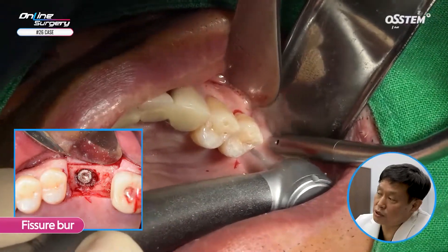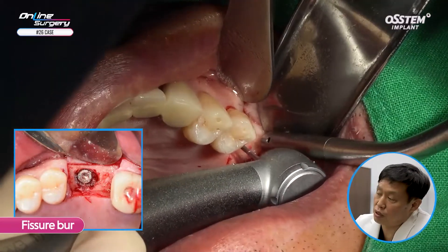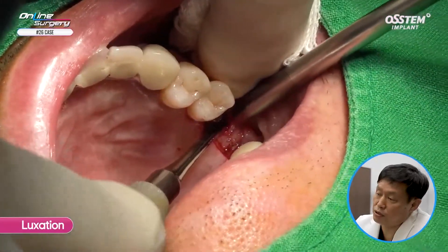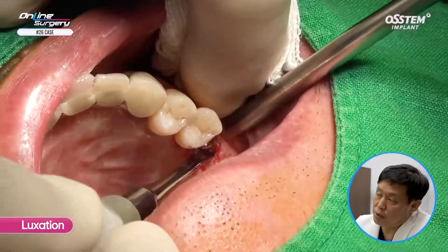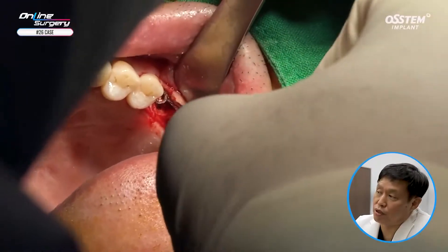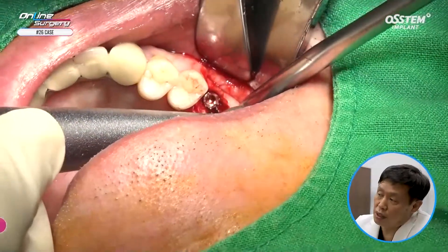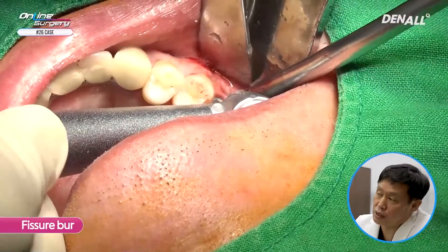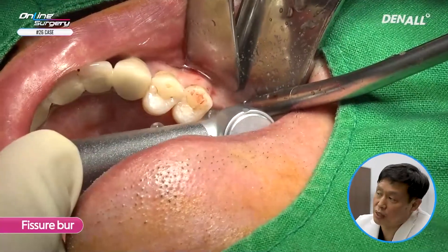As mentioned, the buccal plate is extremely thin. In order to preserve it, I am going to use a thin fissure burr to prep the site where fulcrum can be gained, and use an elevator to do luxation on the implant. It was an 11.5 mm long implant — it is not easily luxated. I am going to use the fissure burr once again and remove the alveolar bone more deeply so that fulcrum can be gained mesially and distally.